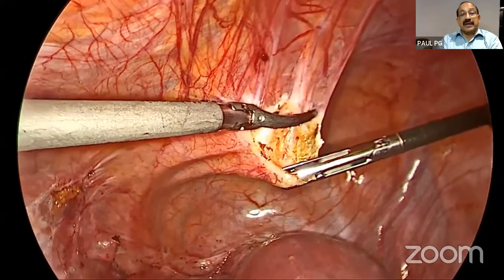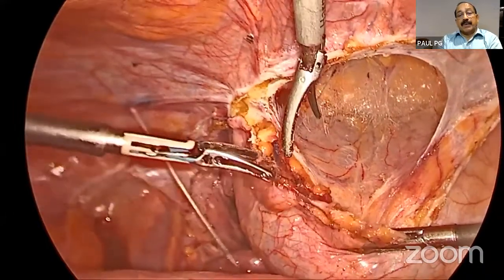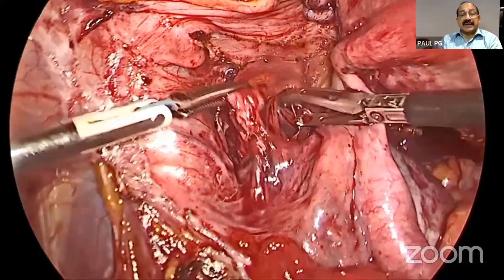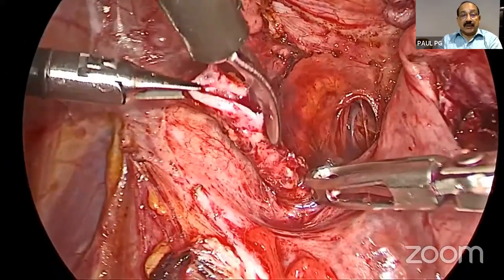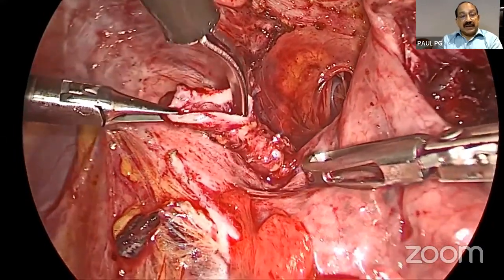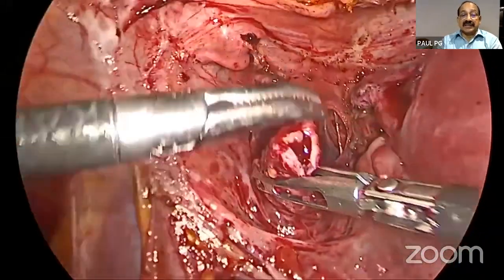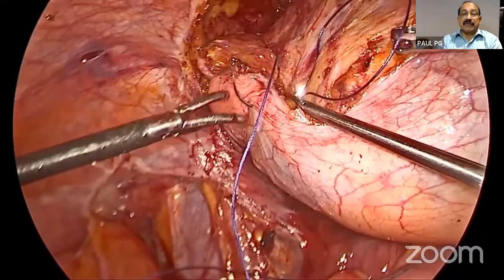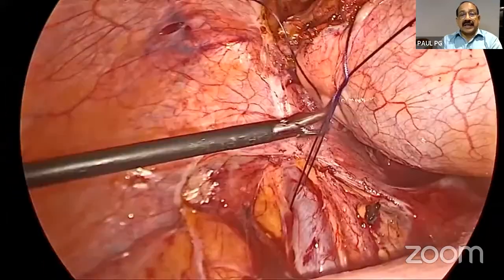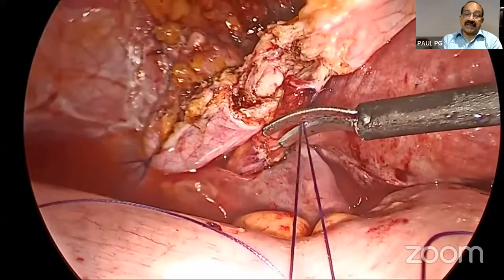we decided to have a ureteroneocystostomy. You have to open the Retzius space to reduce the tension at the anastomotic site, and this is the transected ureter. It was fish mouth after excising, freshening the edges. We need to make it fish mouth, and before actually doing the anastomosis, a psoas hitch was done to reduce the tension at the anastomotic site.